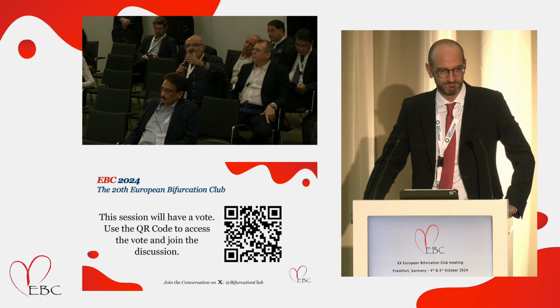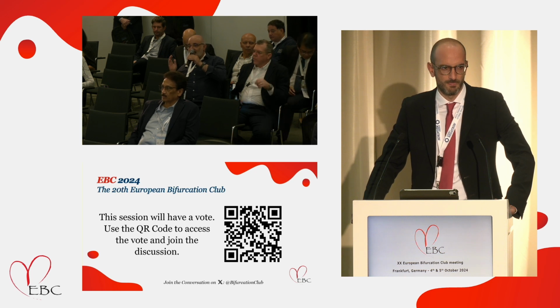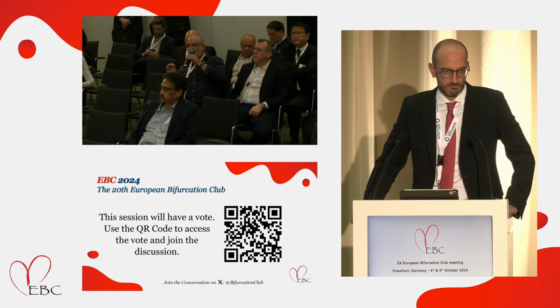Yeah, and you're right. I understand you say that it felt good, but I do a lot of CTOs, and a Pro 12 and a Gaia 3 will go anywhere, and it feels good wherever it goes because it's like a needle. It cuts through anything. So my only criticism is, you got a good result, but I think we can't take shortcuts when we're doing cases. You have to do the retrograde injection. You have to know where you're going, because it ended up well, but it could have been a disaster as well. You have to see where you're going.